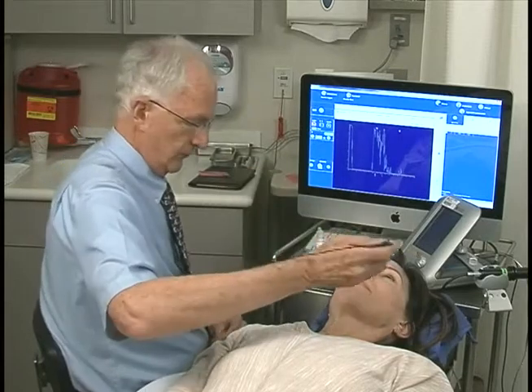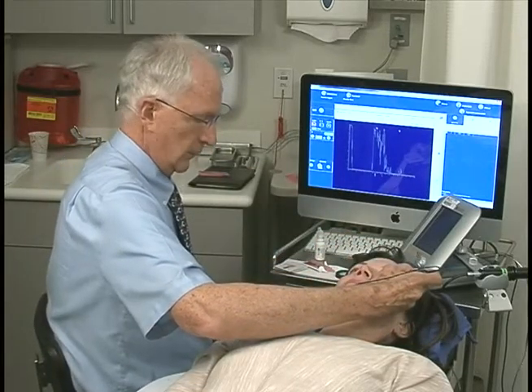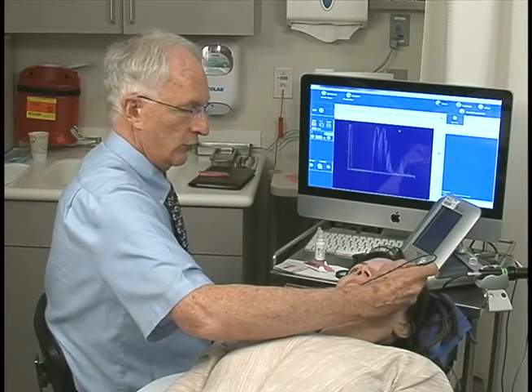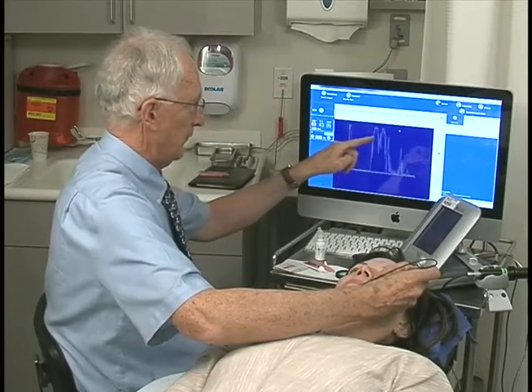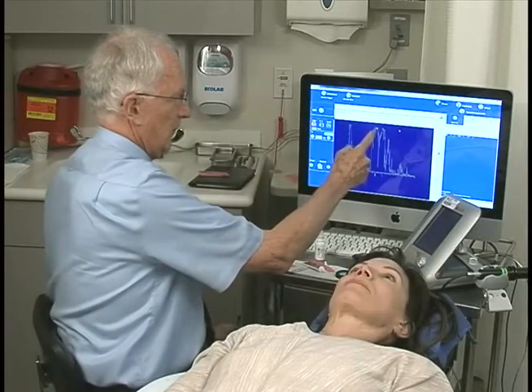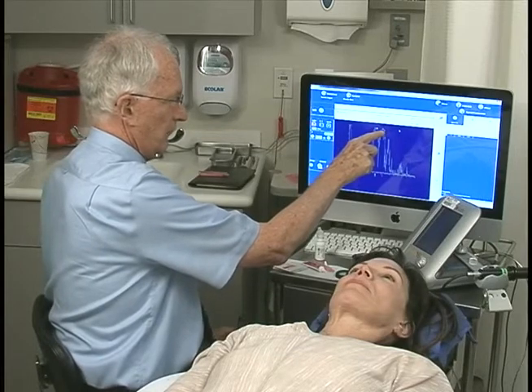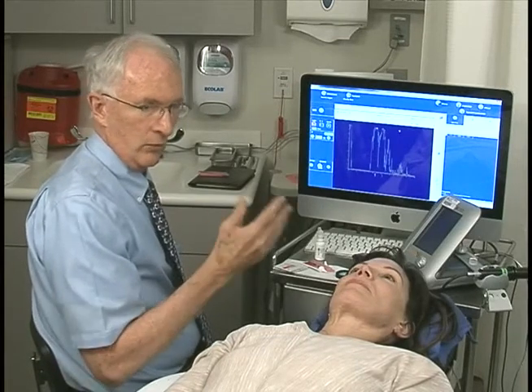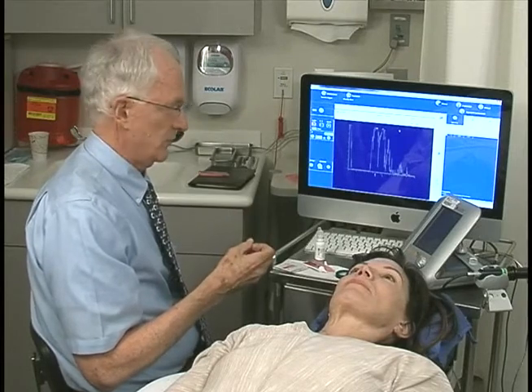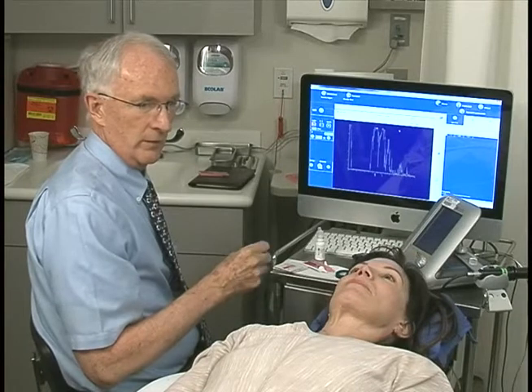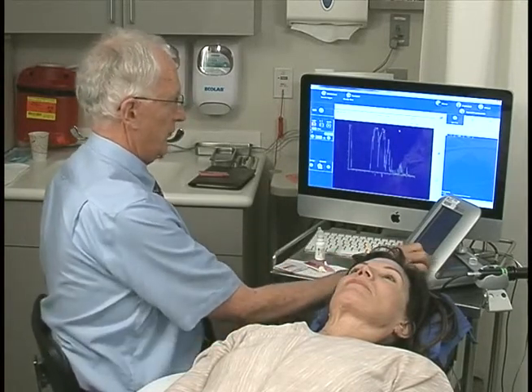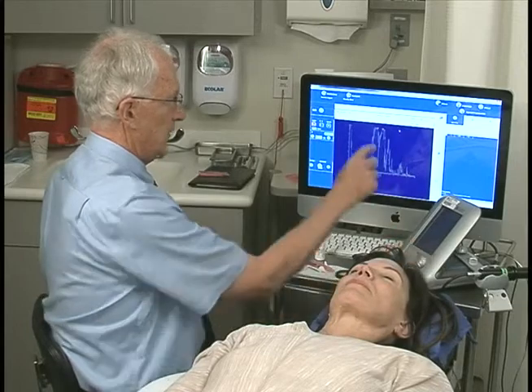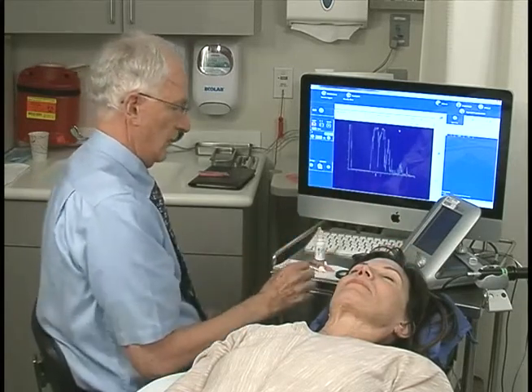I then look at the medial rectus muscle by placing the probe on the lateral globe and aiming nasally towards the medial rectus muscle. I move the probe back and forth with little microscopic movements, side to side and up and down, watching for a dip in reflectivity, and I freeze that. I can see the pattern of the muscle compared to the normal orbit, which is high-reflective on both sides. But you see the dip in the pattern because the muscle is more homogeneous than adjacent orbital tissue. Normal orbit is quite high-reflective because of many interfaces, while muscles are more homogeneous and tend to be a little bit lower-reflective normally. I measure the muscle sheath of the medial rectus muscle and get a measurement of 4.42 millimeters.